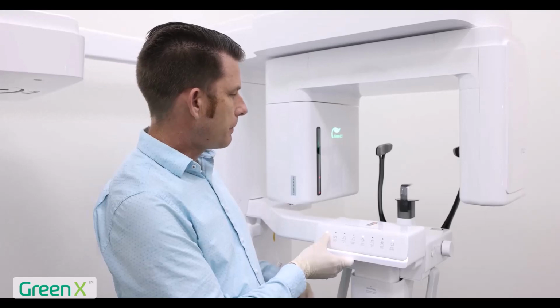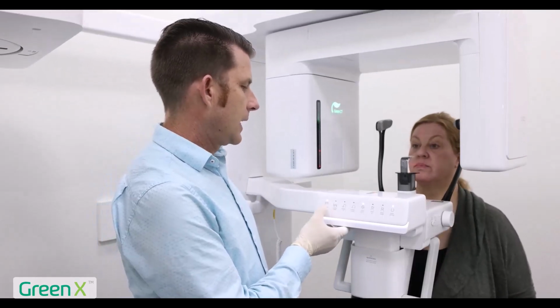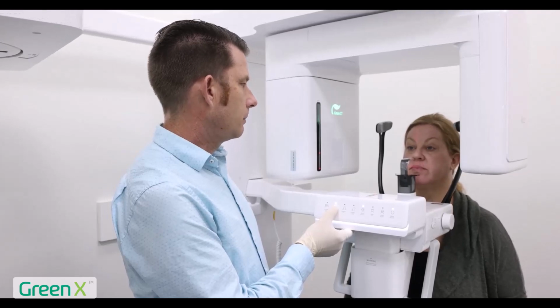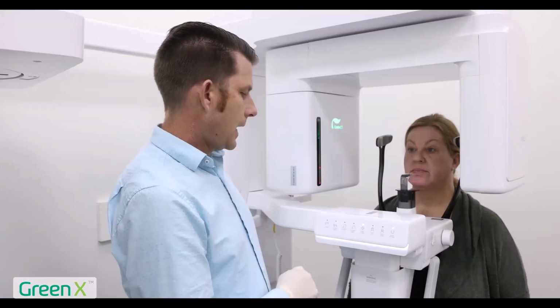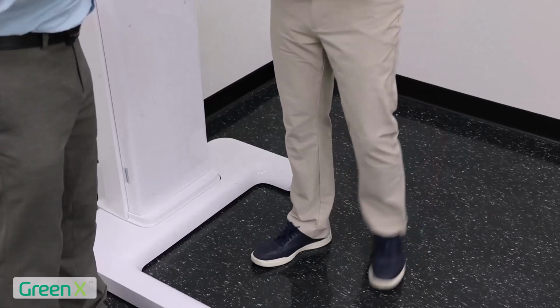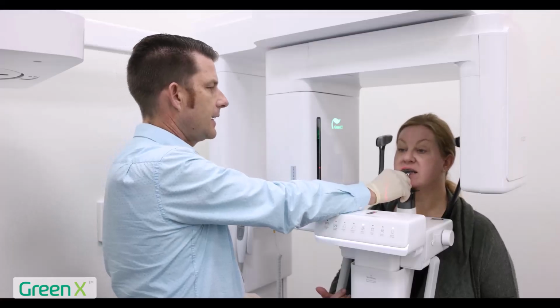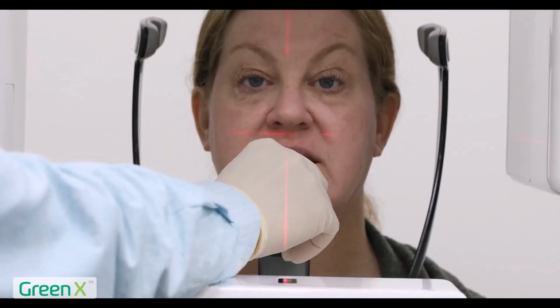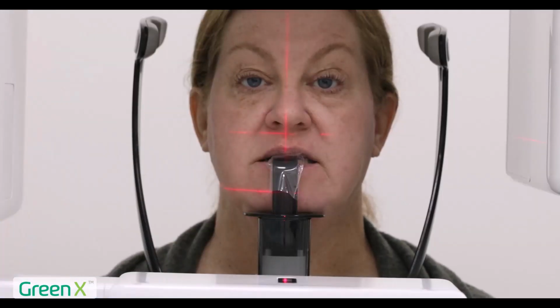So let's raise this up. I'm going to have my patient go ahead and stand over here. Stand up straight and tall for me. I'm going to lower the column down. I'm going to have my patient hold with the palms facing up, feet shoulder length apart. Bring the patient onto the bite stick and bite in the bite stick groove. And I'm going to make sure their chin is firmly on the chin rest.